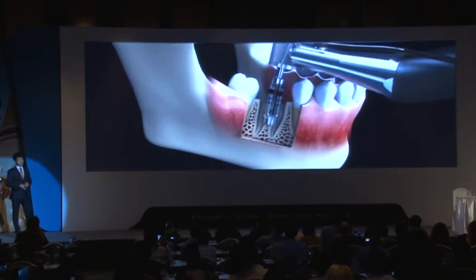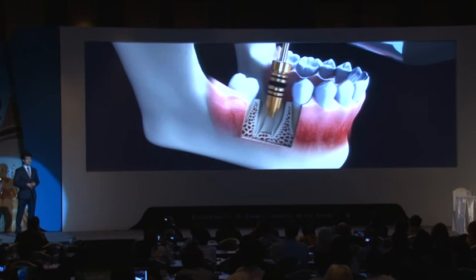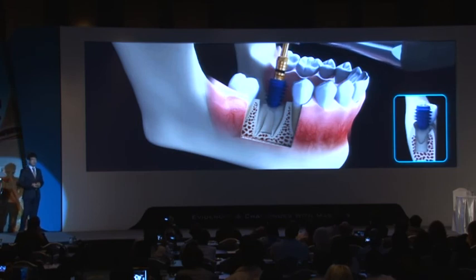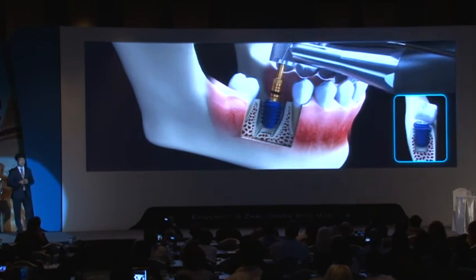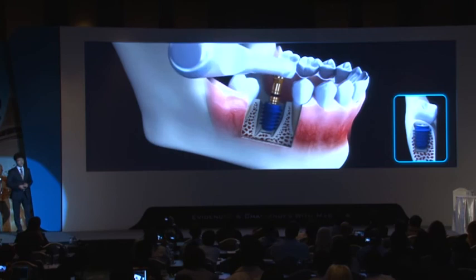Drilling sequence is very simple when you are using the Tapered drill. And the final drill can be used. And I've usually been using a super wide Anyridge in case of immediate implant placement at the posterior area. Super wide Anyridge has always offered excellent initial stability.